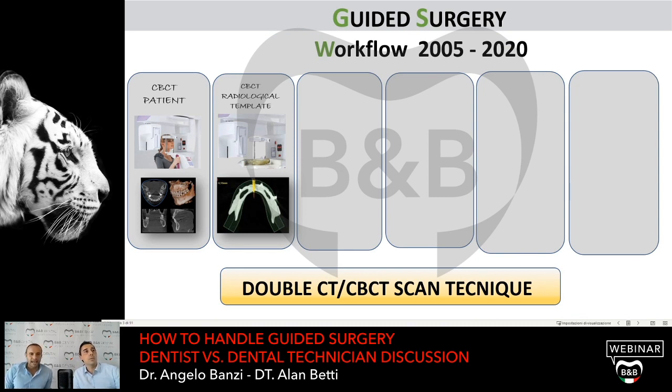The first case, as Alan has mentioned before, is a full arch rehabilitation, upper jaw and lower jaw, following the original method, this double CT combine scan. This method was, we can say, invented by Daniel Vanstenberg more than 15 years ago, and is actually a method that I use today.